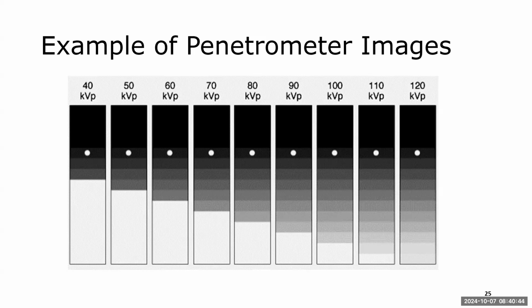Now, what you don't want to do is get the kVp confused. Which kind of kVp gives you lots of shades of gray, long grayscale, low contrast? Higher kVp. Yes. So don't throw in low kVp in that, because that's not true. When we're talking about low contrast, lots of shades of gray, long grayscale, we get that from high kVp, because it's an inverse relationship. The higher the kVp, the lower the subject contrast.